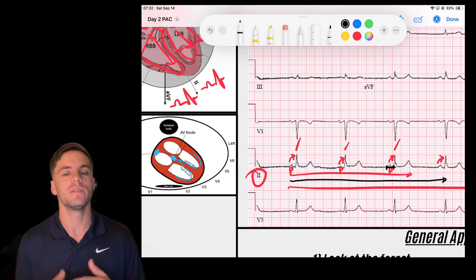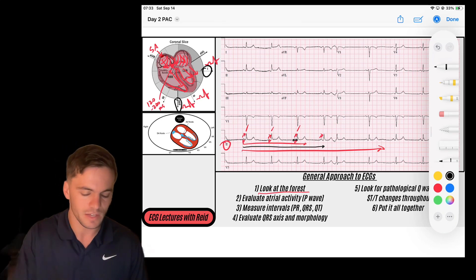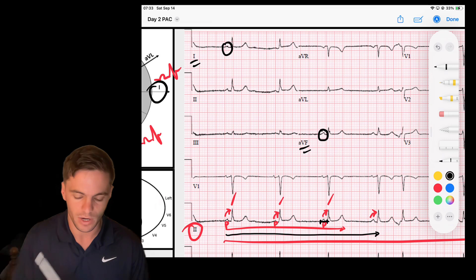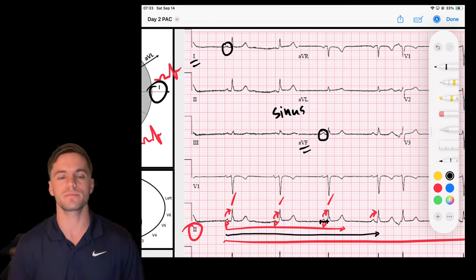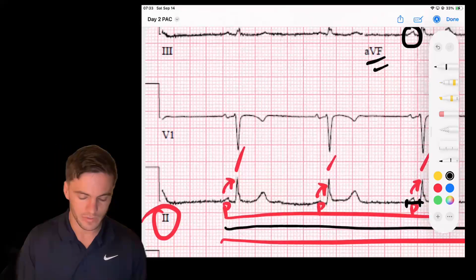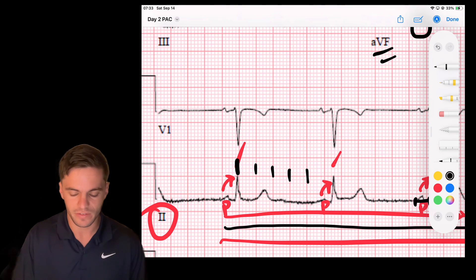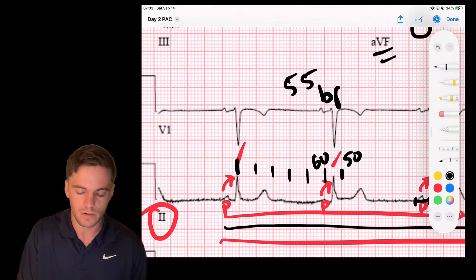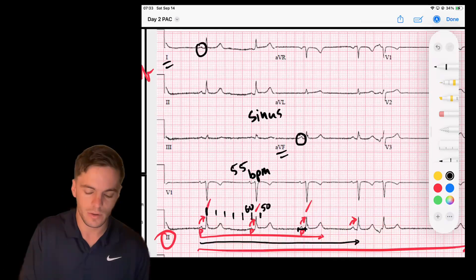We can verify that these P waves are coming from the sinus node by checking their morphology — upright in leads one and AVF. Those are our sinus P waves, confirming a sinus rhythm. Measuring the rate by counting 300, 150, 100, 75, 60 — this falls somewhere between 50 and 60, maybe 55 beats per minute. The sinus node is just under 60, so we can call this a sinus bradycardia.